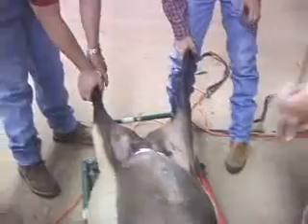Following the completion of AI, the two trocars are then removed from the body cavity. Antibiotic and surgical glue are then applied to the incision sites. If ovulation, as determined by follicular size, is not within 12 hours, an IV injection of GnRH is given to accelerate the time of ovulation.